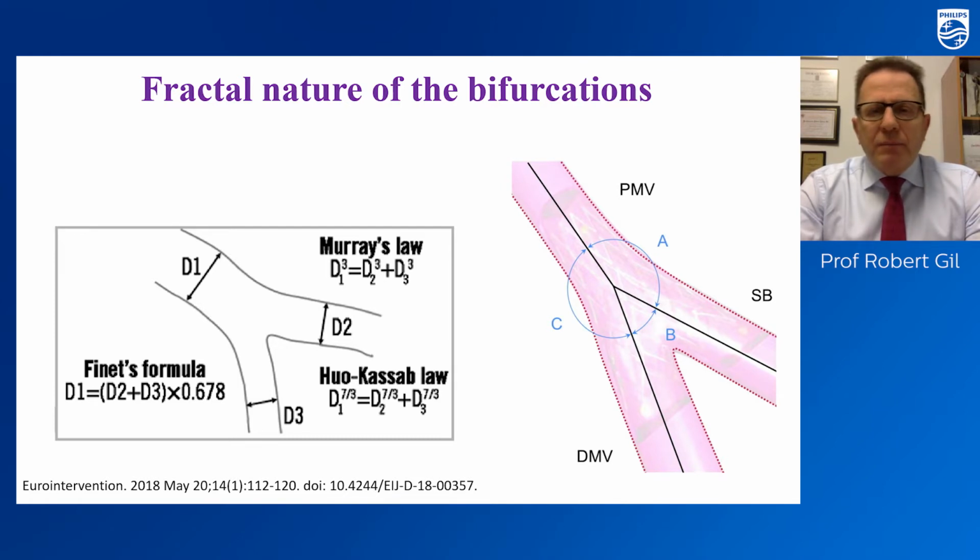But we have to remember that always during interventional procedures we can face difficult decisions. Therefore, the scientific background, the knowledge regarding the region of interest, I mean coronary bifurcations, is very important. So I would like to start by showing you the standard language and some rules which are necessary to take the right decision during coronary bifurcation treatment.